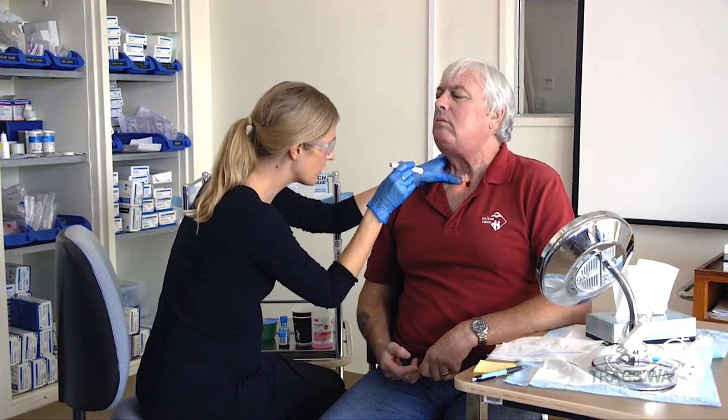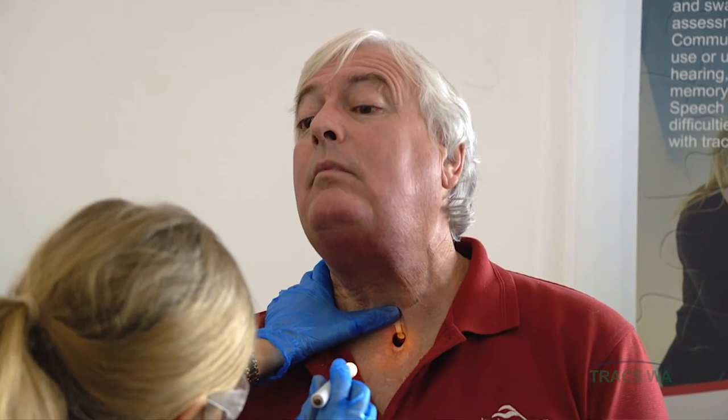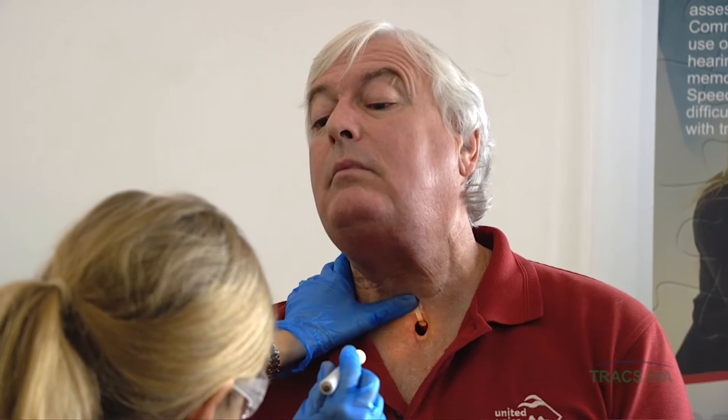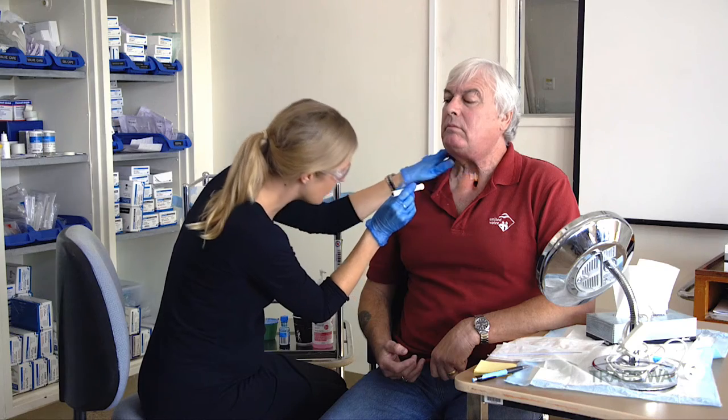So the stoma looks really good. It's really clear of any secretions. I can't see any mucus or anything that's built up that might account for the trouble with your voicing. The valve looks like it's in a really good position. Try and count from 1 to 10 for me. I'm just going to have a bit more of a look at your voice.